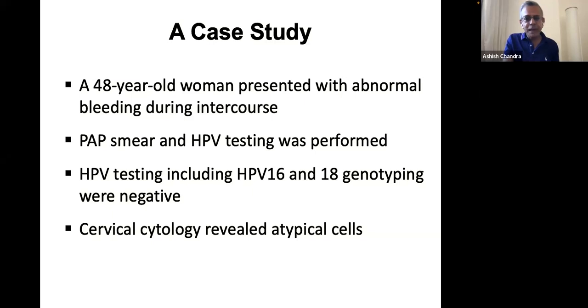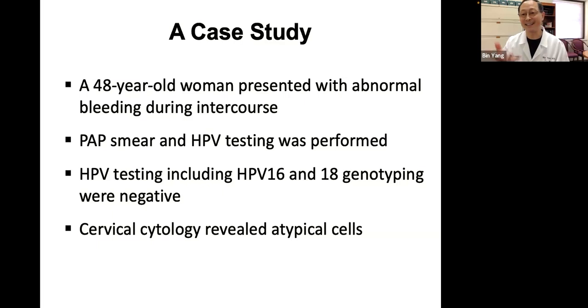So I think you may have already in part answered this question, but do you give a diagnosis of ASC-H with LSIL changes present, or is ASC-H sufficient? Yeah, we use that. So Ashish, you know that, right?